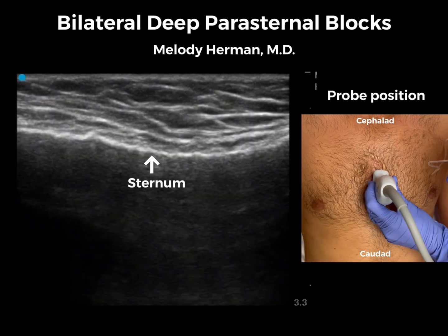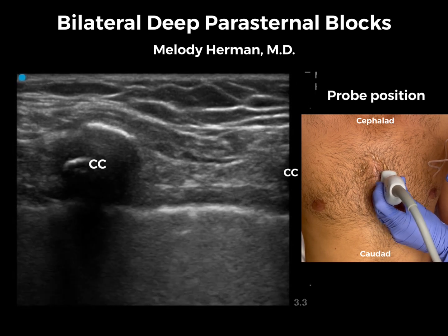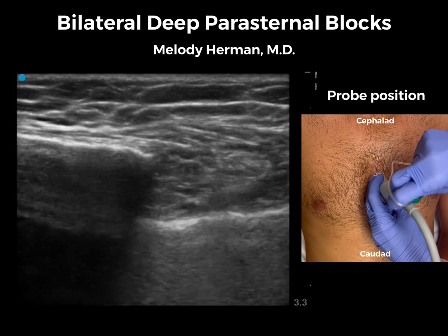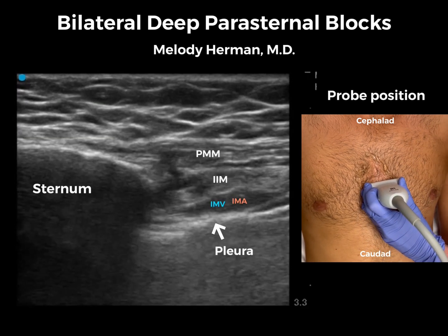Now that our right-sided deep parasternal block is complete, we're going to move on to our left side. We'll start with the probe in the sagittal orientation over the sternum, slide a little bit laterally to identify the costal cartilages, and then turn to the transverse orientation so that we can see our mammary vessels in short axis next to the sternum.